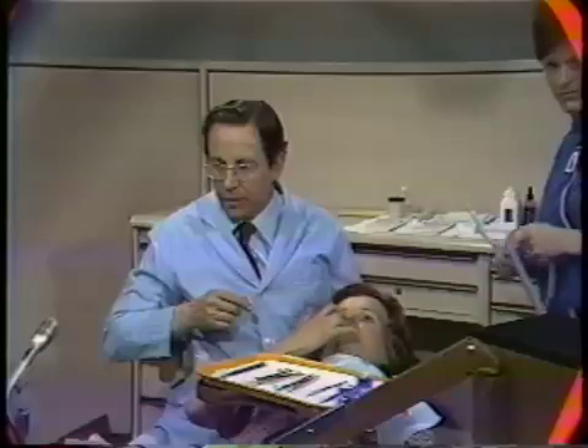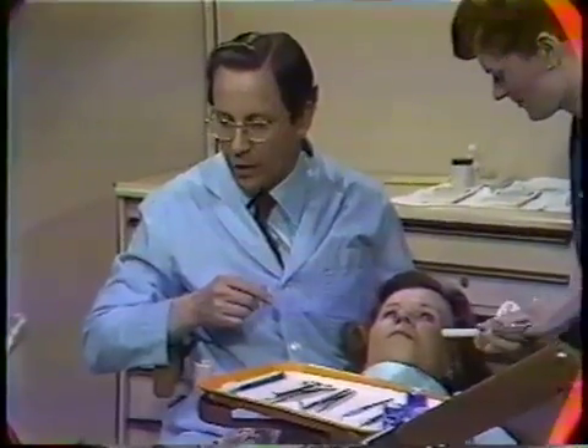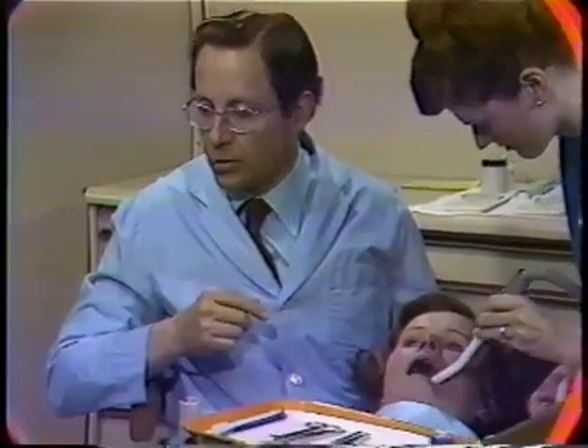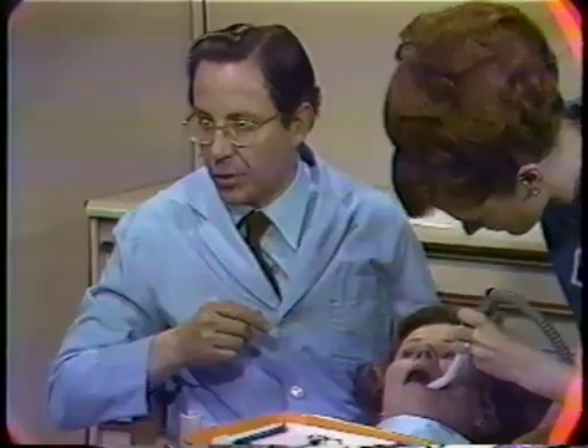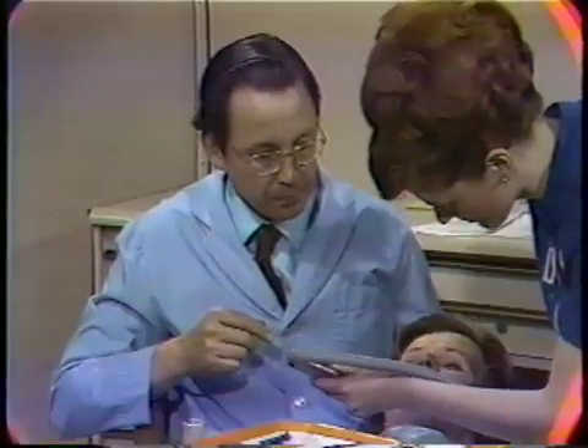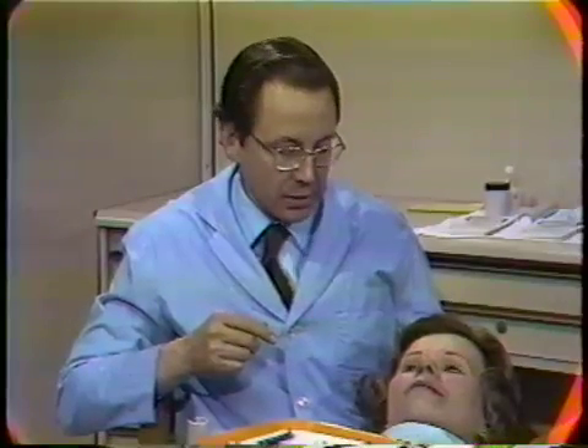One of the reasons for using the xylocaine is that since there was a gingivectomy performed in this area and there will have to be another dressing placed, it's a little more comfortable on the tissues to have the surface areas slightly anesthetized with the topical anesthetic. When evacuating, the assistant is always careful of the surgerized area because it is a little uncomfortable at first.